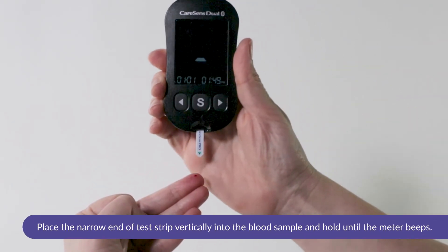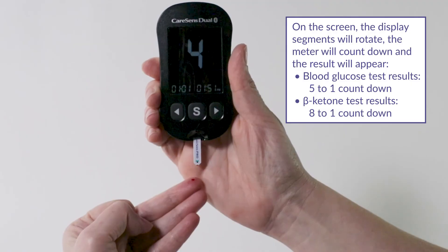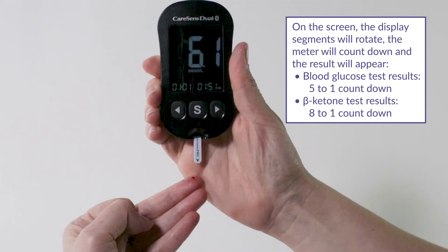Place the narrow end of the test strip vertically into the blood sample and hold until the meter beeps. On the screen the display segments will rotate, the meter will count down and the result will appear.